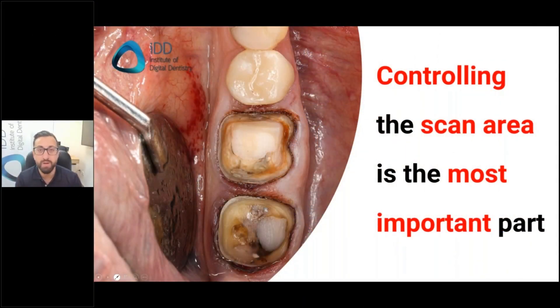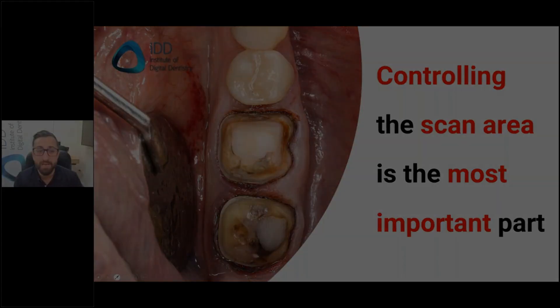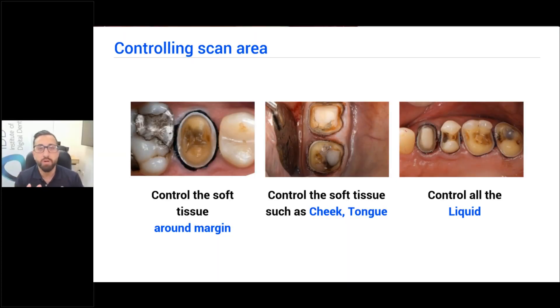If you control this area properly, scanning is very fast and very accurate. This is what makes scanning so good if you do it correctly — because if you control this area properly, scanning is very fast, it's very accurate. You just can't think of taking an impression ever again in your practice.